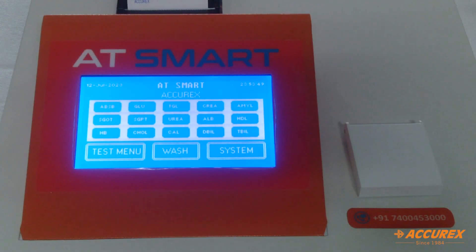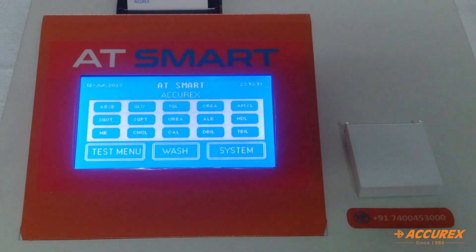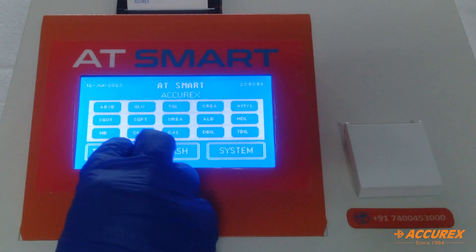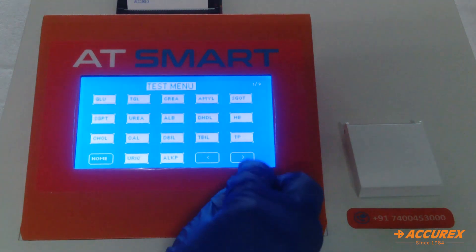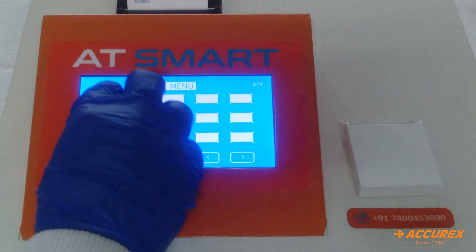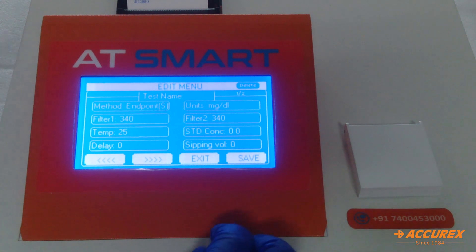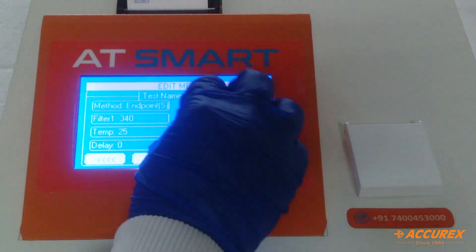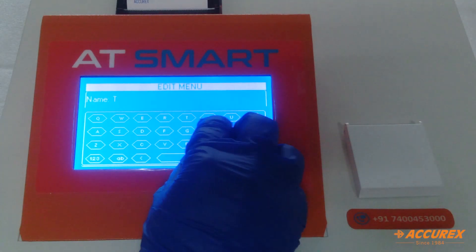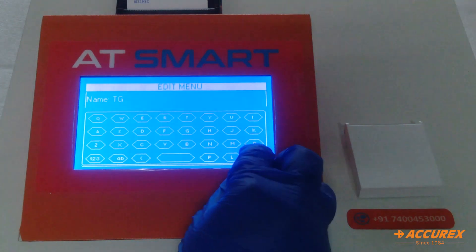For the programming part, we are using the AT Smart instrument. Go to the test menu, select any blank test. First, enter the test name: press TG and save.